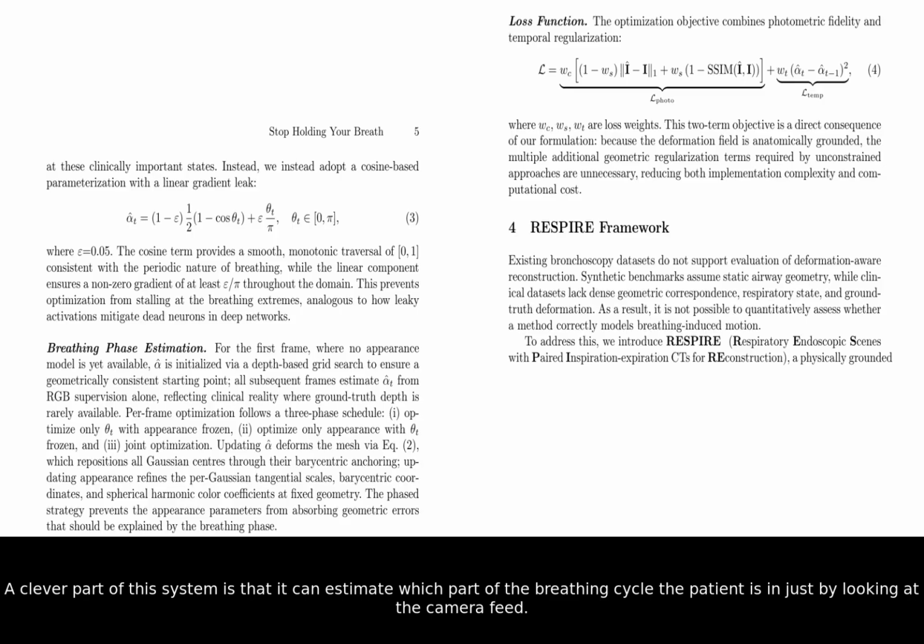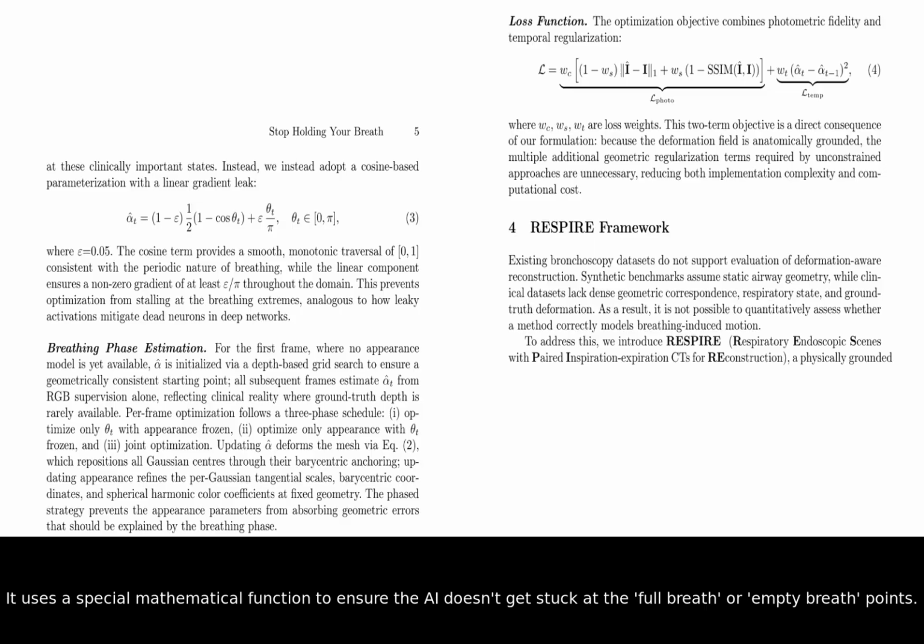A clever part of this system is that it can estimate which part of the breathing cycle the patient is in just by looking at the camera feed. It uses a special mathematical function to ensure the AI doesn't get stuck at the full breath or empty breath points.